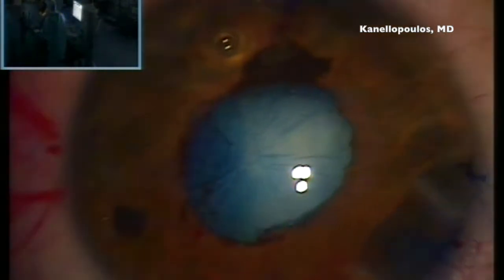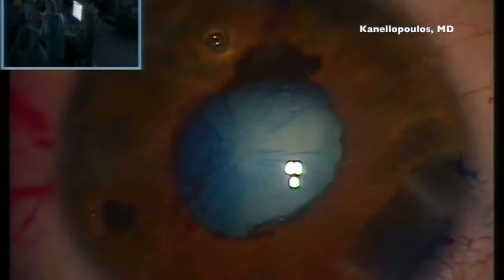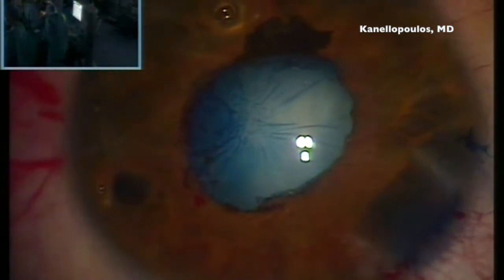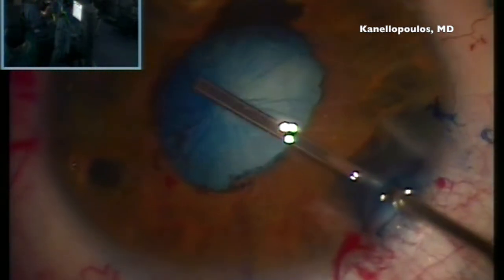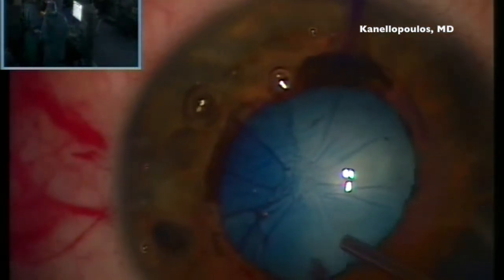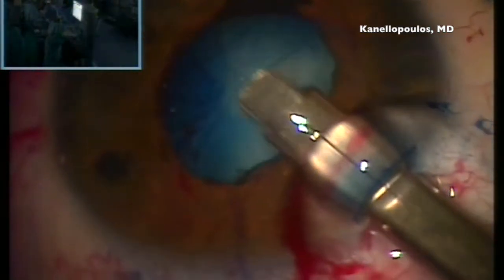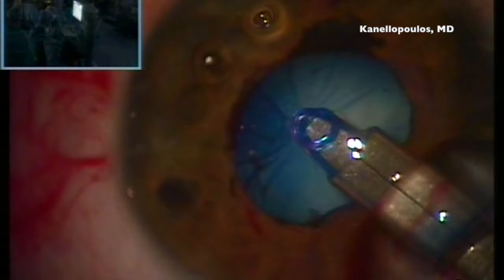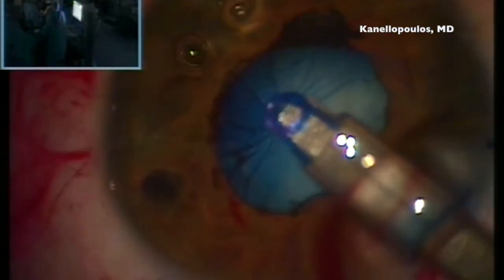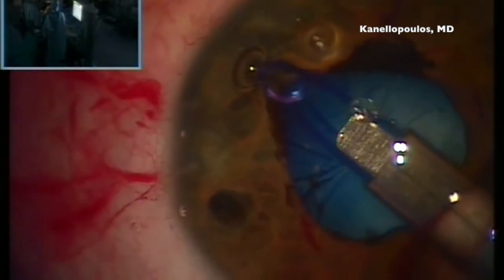I don't feel comfortable proceeding with my phaco procedure with a pupillary aperture so small and the iris so floppy, as you saw before. So we're going to pull out our disposable Malyugin ring from our cabinet, use more Viscoat to enlarge the pupil as much as possible, also fill the anterior chamber, and we're coming in here with a Malyugin ring inserter. See how beautiful and easy it is, and this is a key element of its becoming so successful as a surgical tool for the everyday anterior segment surgeon.